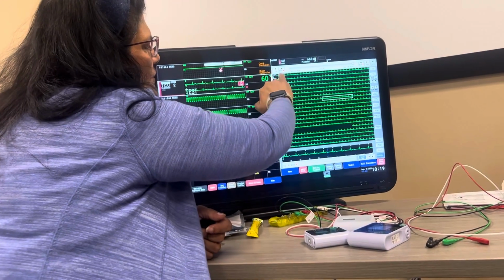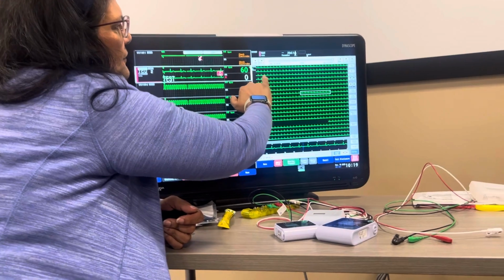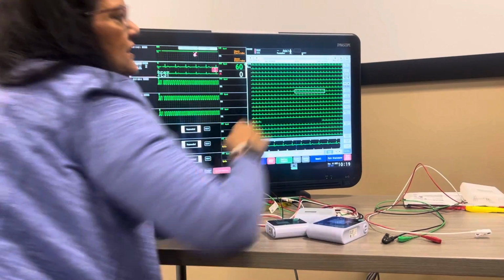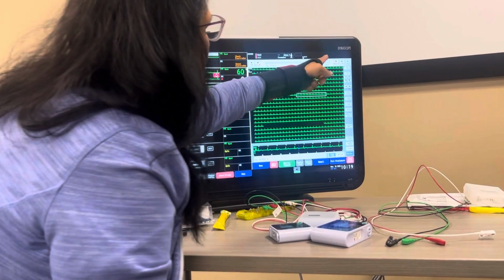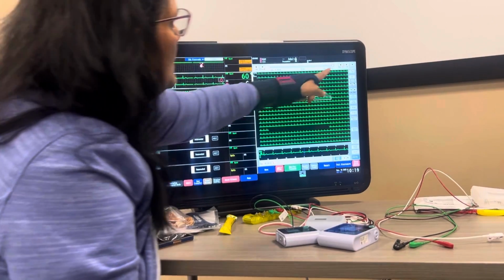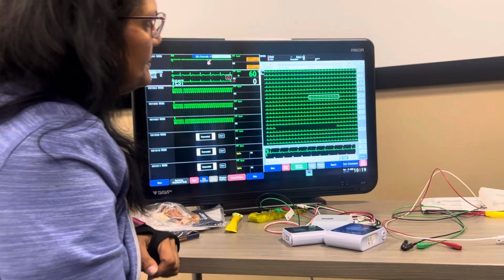But otherwise, you can go to previous page, or you can go to 24 hours before. And if you start scrolling through that, you'll get lost somewhere along the line, and just click on the latest to get back to the current area. All these red lines up here show you that there was an alarm at that time. So you can click it by that too. I think the easiest is the time search though.